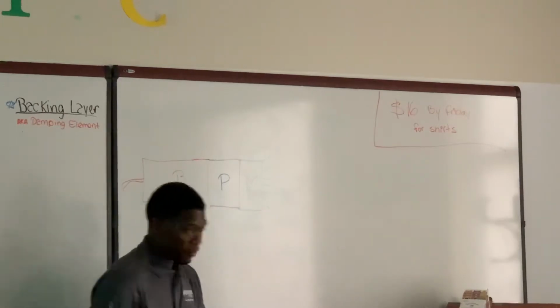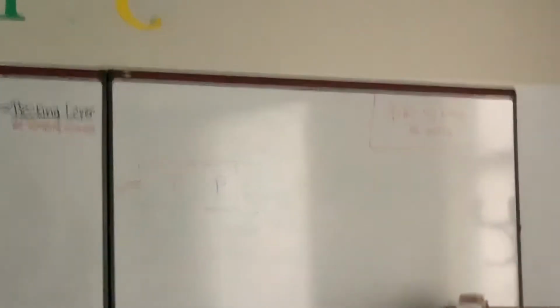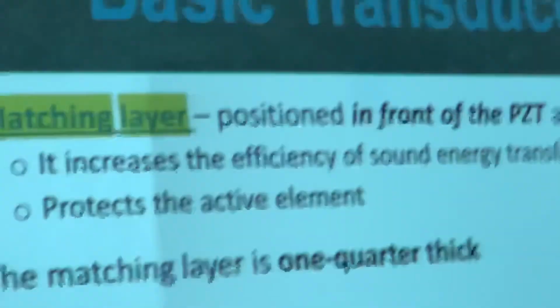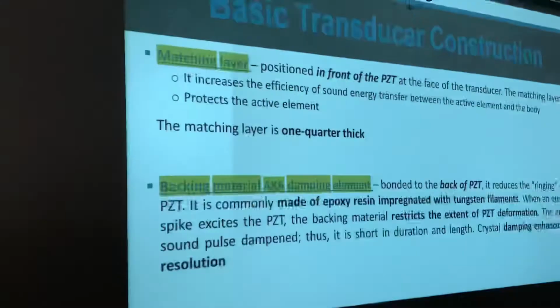Know that a synonym for backing is also the damping element. That's bonded to the back of the PZT. It reduces the ringing of the PZT, as I already said. It's going to stop it from ringing so that we can listen during reception.